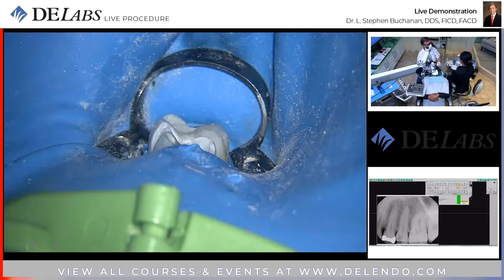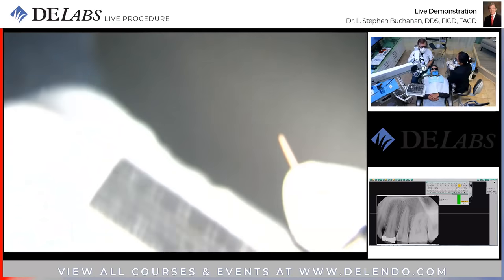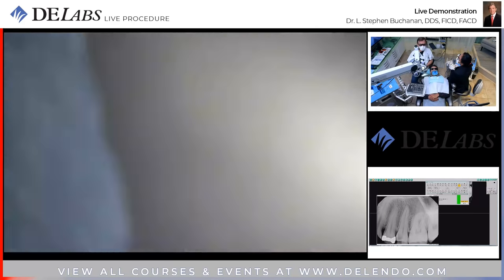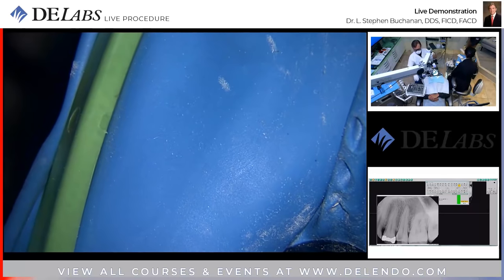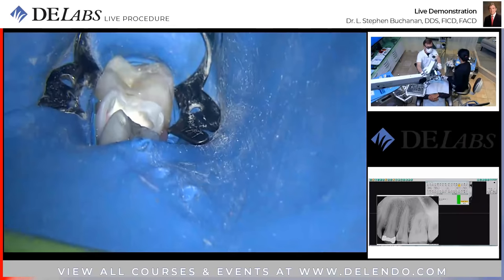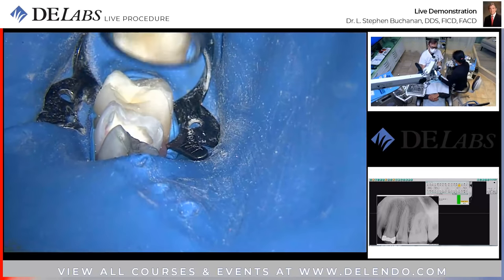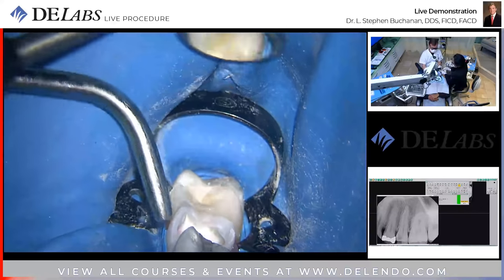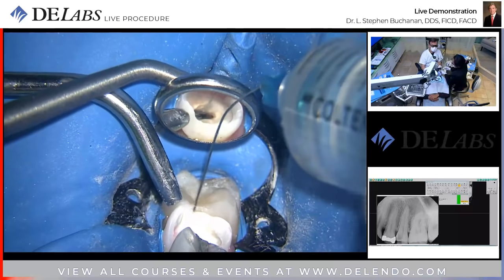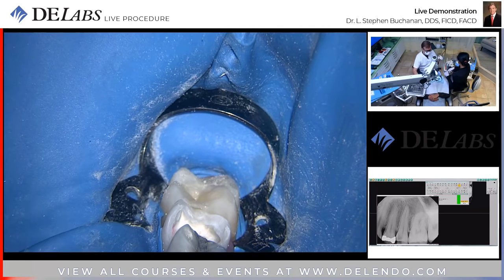And it was the lingual cusp tip, right? Yeah. Okay. Where is this measuring? Okay. Let's gauge it again. EDTA solution. It's a nice case example. This is a thing that a lot of people fuss with, have challenged, probably the most challenging part of GentleWave once you learn how to make a good platform. Get in there, okay. All right, so gauging.